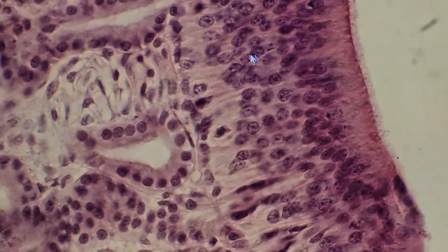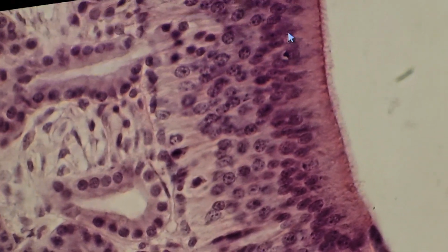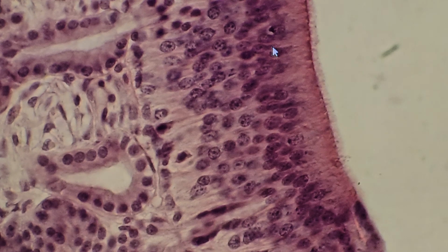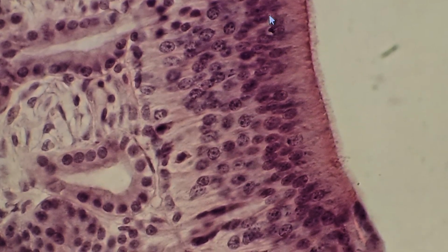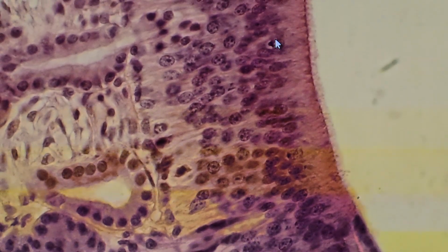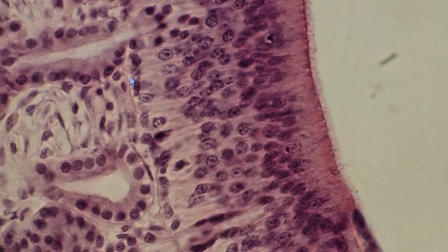Olfactory neurons. The third type is the supporting cells. Supporting cells are columnar cells. Each cell has a dilated apical portion with narrow ends. These are nuclei of supporting cells. Supporting cells, olfactory neurons, basal cells.